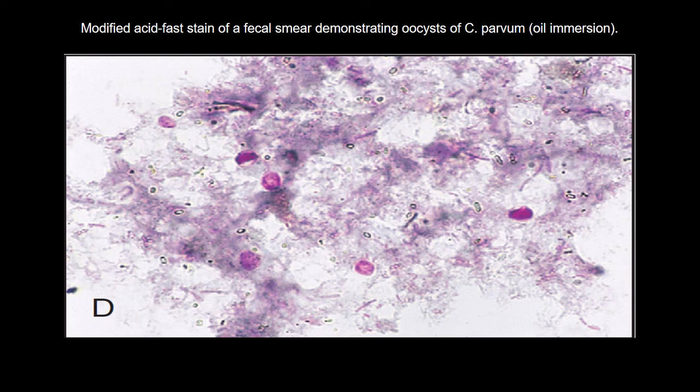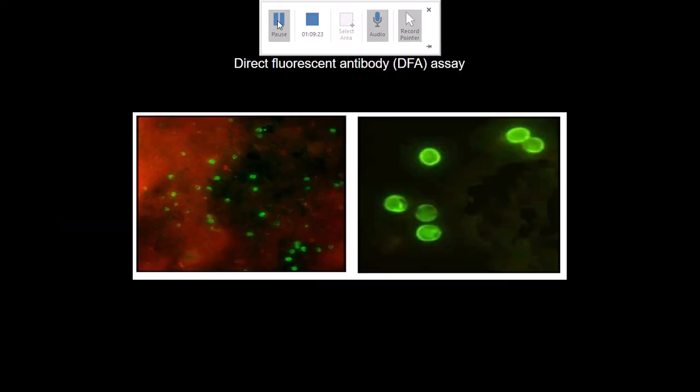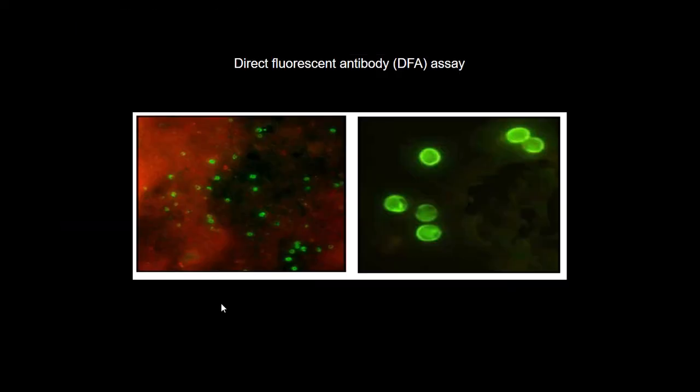To make the diagnosis of the diarrhea, Cryptosporidium parvum. And sometimes in parasitology, especially in protozoa, we could use the direct fluorescent antibody to make the diagnosis.